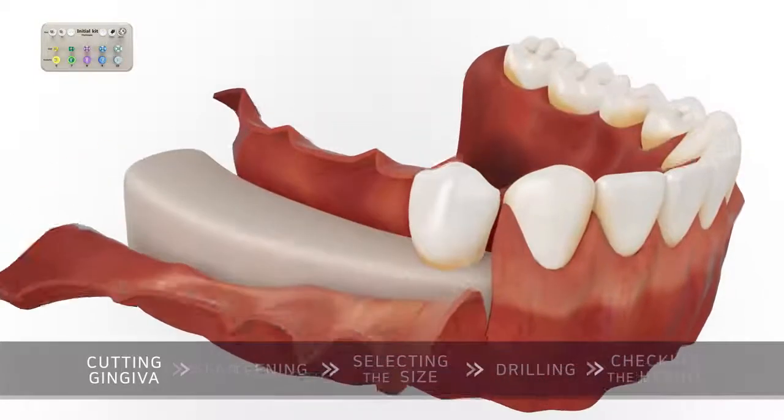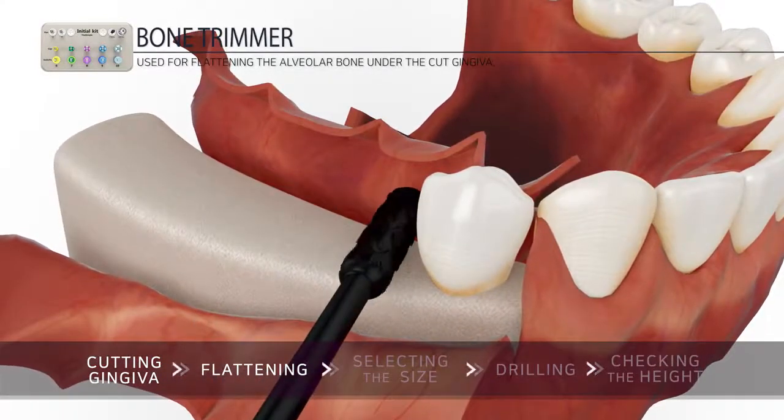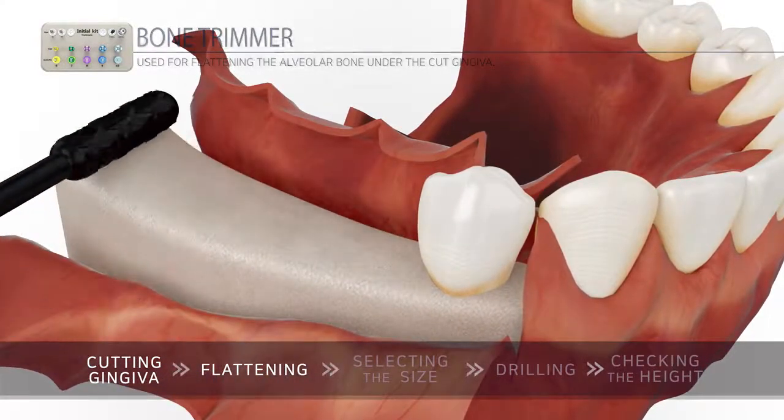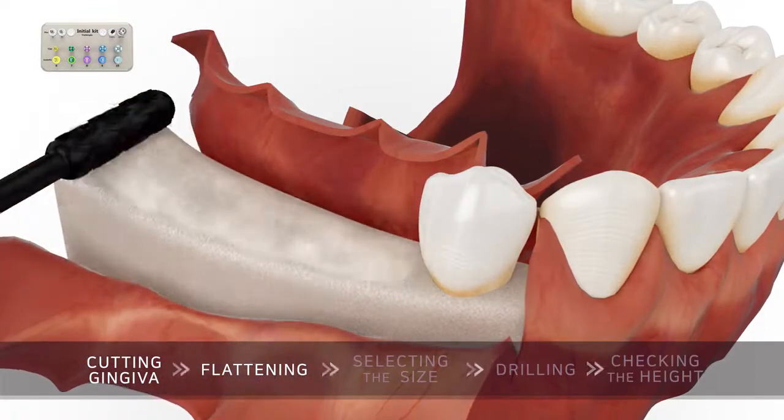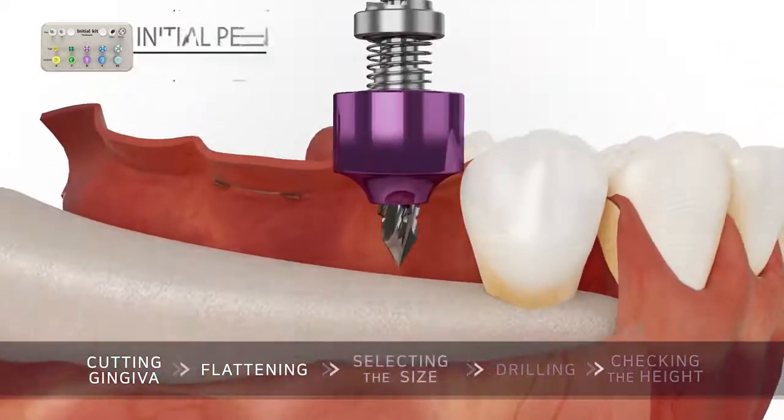First, expose the gingiva on the area of implants to be placed and flatten the alveolar bone with the bone trimmer. Then select the appropriate cup size while adjusting the space where the implant is to be placed.